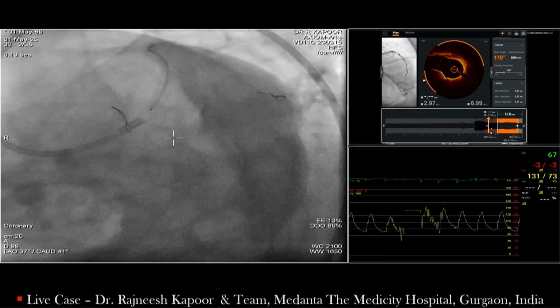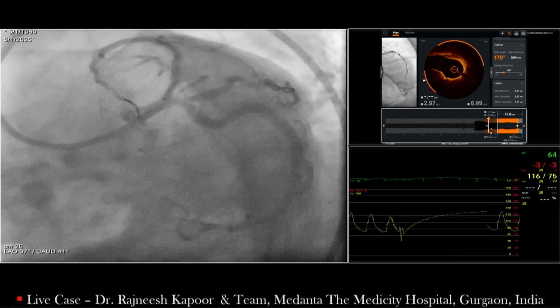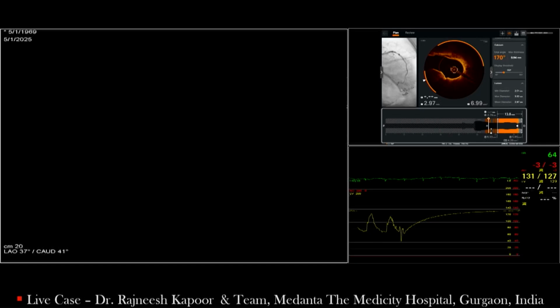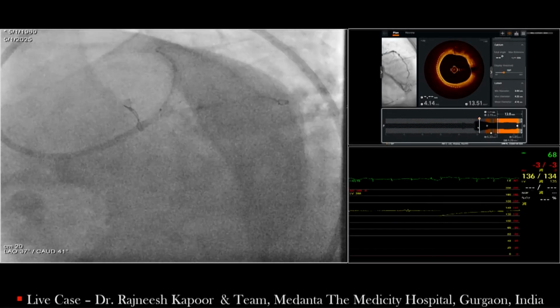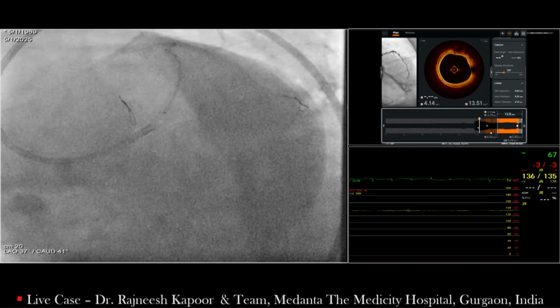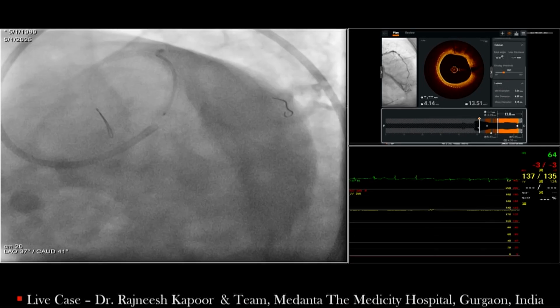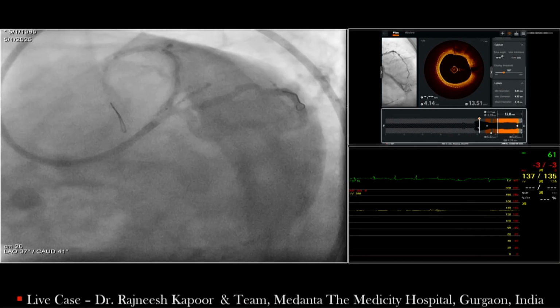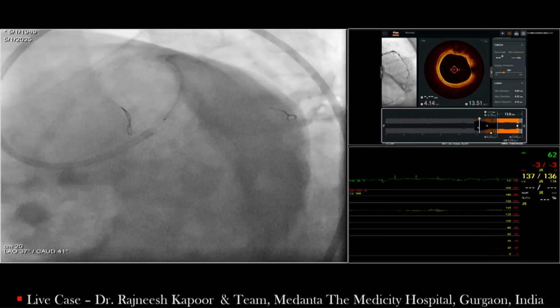Absolutely. We have done one more OCT, which I'm showing you in a second. Okay, you go ahead and we'll watch, and then we'll make final comments after you repeat another OCT. But obviously we have done our own studies where we looked at precise placement of stent versus crossover. Crossover is recommended, at least in our study.